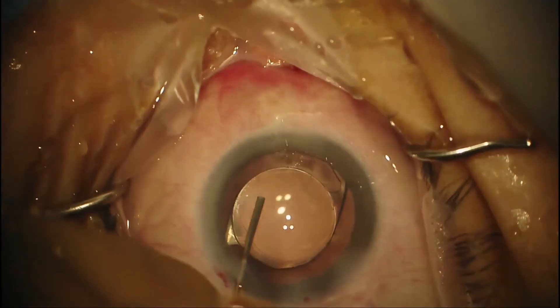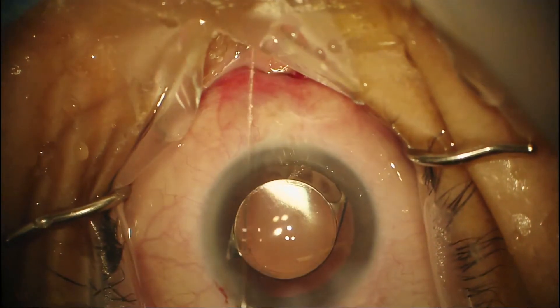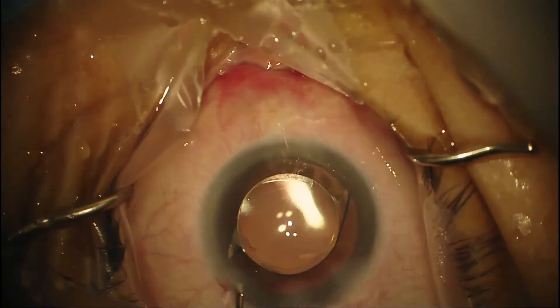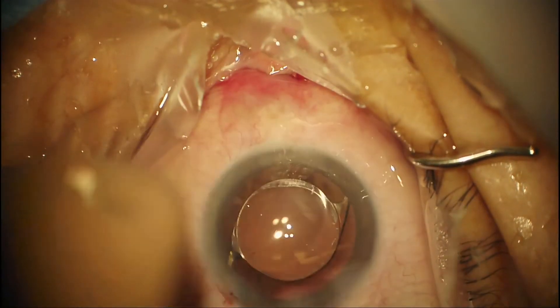The last step is stromal hydration of the main wound and of the paracentesis and any intracameral antibiotics you would inject. These days I'm injecting moxifloxacin at the end of the case, but there's always subconjunctival antibiotics — you do what you can with what you have. I'm getting the lens centered a little better, trying to get as much overlap on the optic. It looks like we have 100% optic coverage. We're just filling up the AC and checking the pressure — and that would conclude the case.